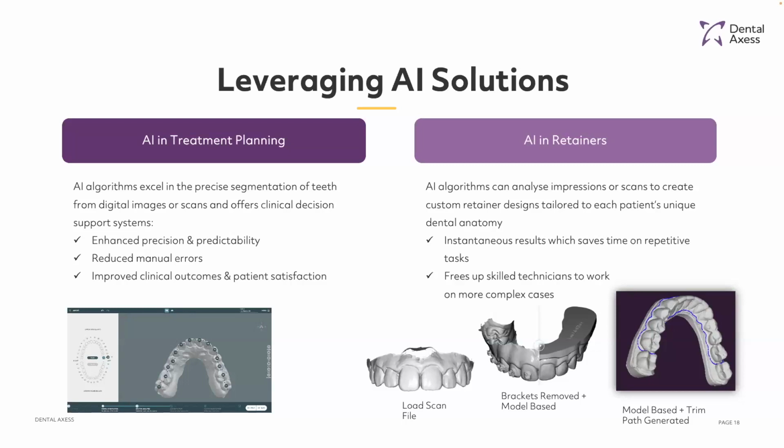The utilization of AI in treatment planning offers unparalleled benefits, as you can see. It empowers dental professionals to optimize workflows, minimize manual interventions, and achieve superior treatment outcomes. With AI, we can deliver more personalized care, enhance patient experiences, and navigate complex cases with confidence. Now, for those that are interested, you can trial out Vision and also test out the AI yourself.